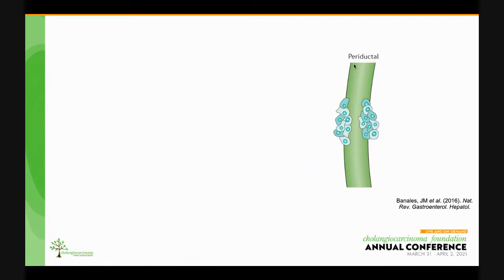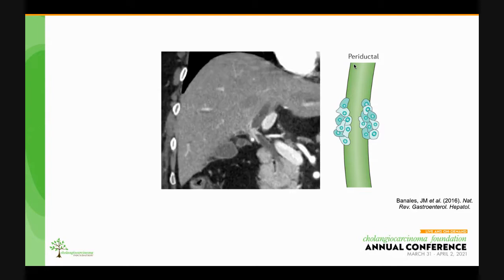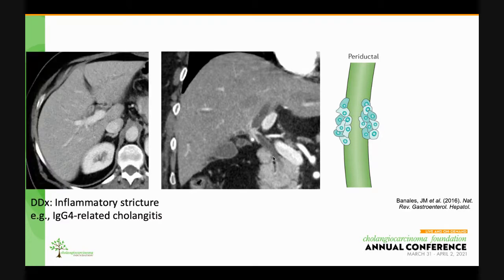The periductal infiltrating type typically begins as tumor cells infiltrating the wall of the bile duct, which results in bile duct wall thickening and enhancement, as you can see in the proximal left hepatic duct and the common hepatic duct in this case. The lumen of the duct is narrowed, resulting in a stricture. There is upstream biliary dilatation. The wall of the uninvolved bile duct, more proximal to the stricture as well as more distal, is usually of normal thickness. Differential diagnosis for this type of cholangiocarcinoma would be with an inflammatory stricture, which also demonstrates wall thickening and enhancement, as in this example of IgG4-related cholangitis.